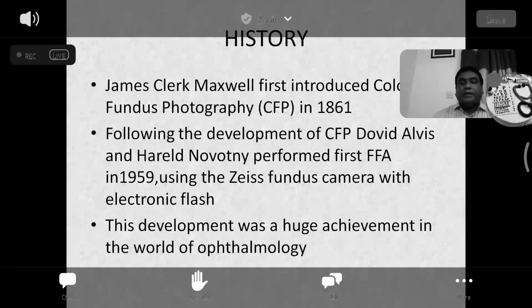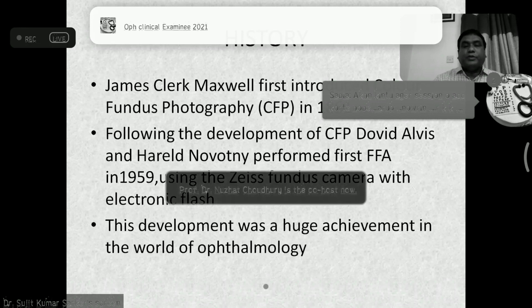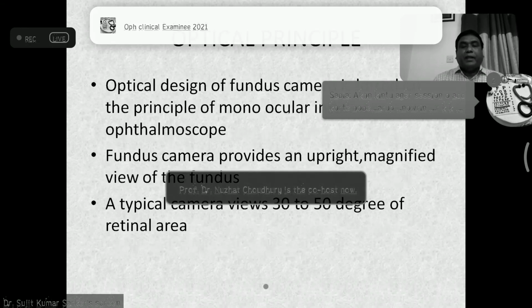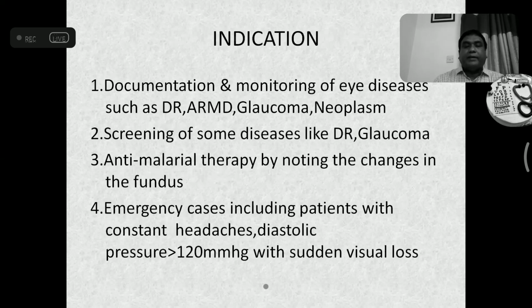Development was a huge achievement in the world of ophthalmology. Optical principle: the optical design of the fundus camera is based on the principle of monocular indirect ophthalmoscopy. The fundus camera provides an upright magnified view of the fundus. A typical camera views 30 to 50 degrees of retinal area.